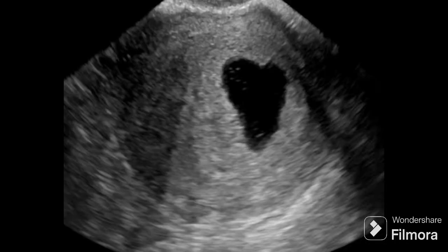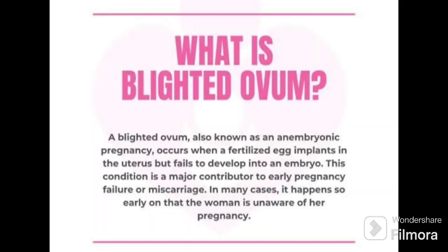This is another case of blighted ovum in which pregnancy has occurred but there is no growth. Now I will tell you what blighted ovum is. It is also known as anembryonic pregnancy. It occurs when a fertilized egg implants in the uterus but fails to develop into an embryo.